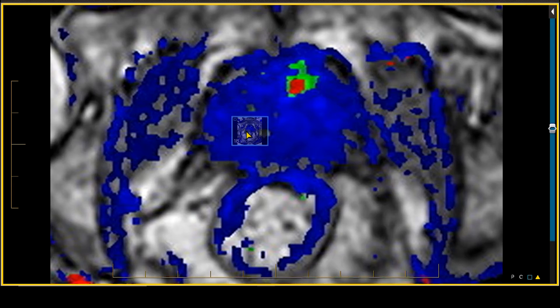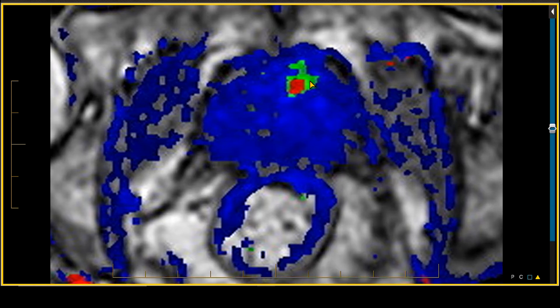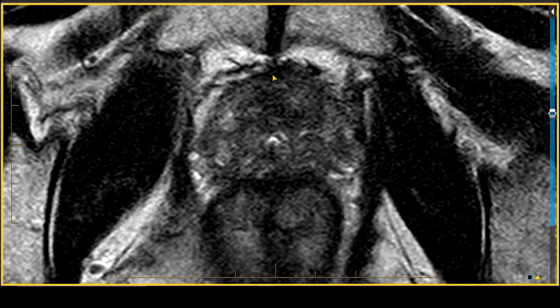On the corresponding dynamic contrast enhanced imaging, the color overlay in this same area shows rapid washout and a rapid plateau pattern of dynamic gadolinium contrast enhancement. Based on the T2-weighted sequence dominating within the transition zone, this is a PI-RADS-5 lesion because it measures over 1.5 centimeters in size.